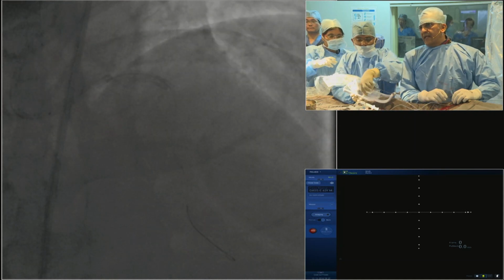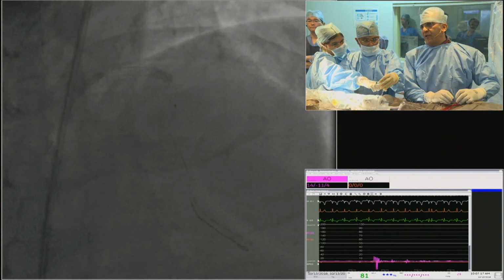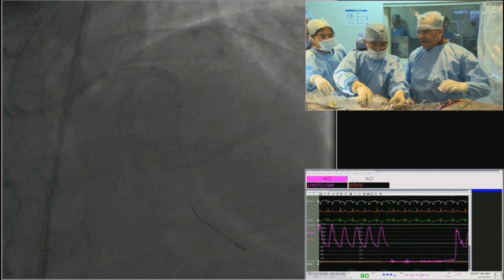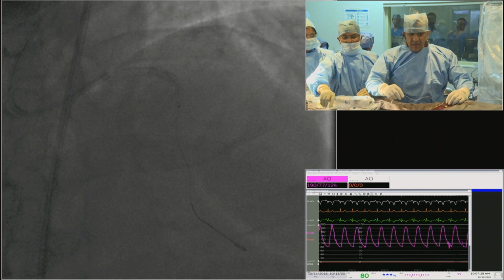One is that I needed to be in a plaque burden which is minimum. It doesn't necessarily have to be a normal looking artery. It has to be a plaque burden of less than 50%, right? With a good large vessel to accommodate a 3.5 stent. Do you think you should use a plaque burden of 50% even in the left main?